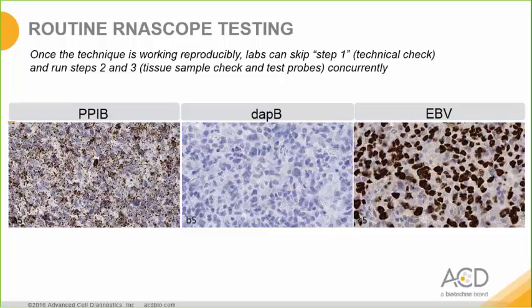Once the technique is working reproducibly, labs can skip the technical check and run the tissue sample check and test probes at the same time. In this RNAscope singleplex experiment with brown chromogen, the positive PPIB control shows moderate levels of expression, while the negative DapB control is clean without signal. So the RNA quality is good, and you can be confident that the signal you see with your test probes is real. In this case, the sample shows high EBV expression with what looks like diffuse staining localized to the nucleus.